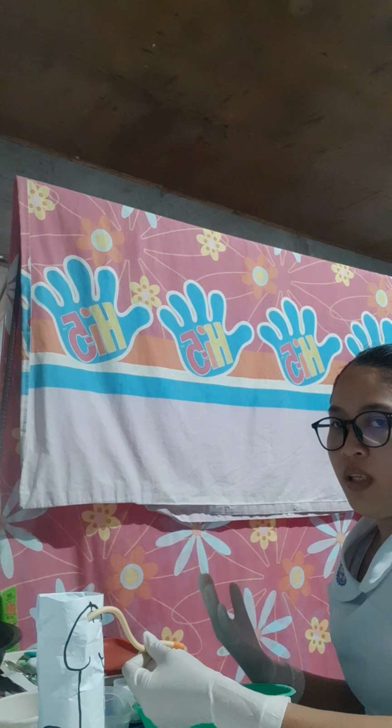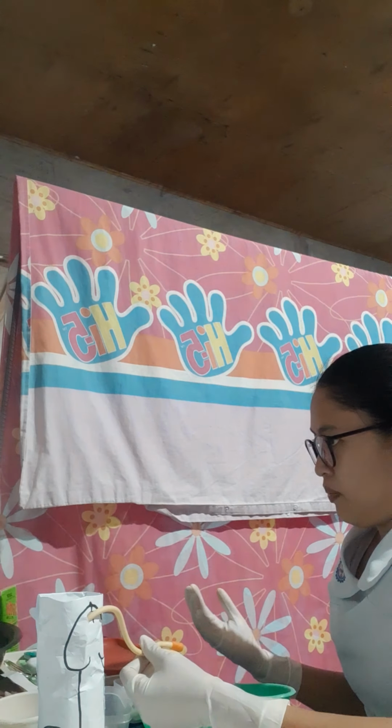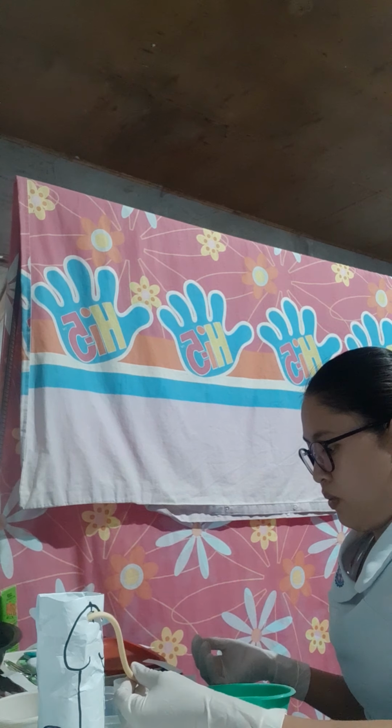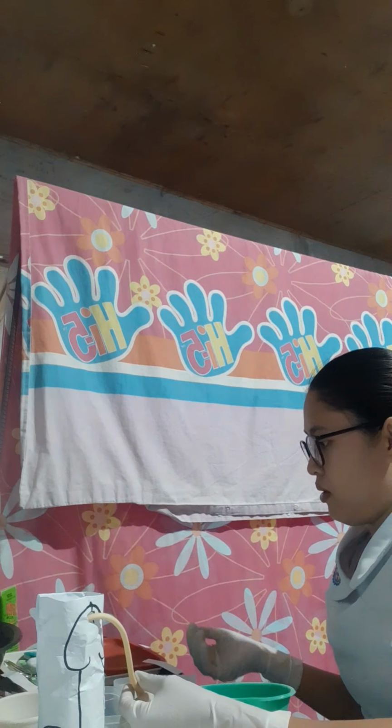While for an indwelling catheter, inflate the balloon of the indwelling catheter. So we're going to inflate the balloon.